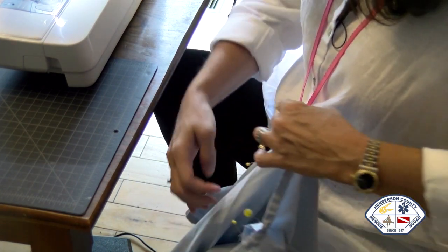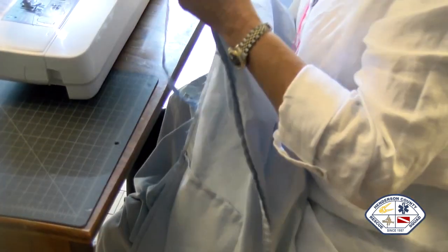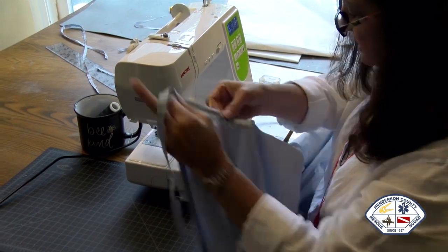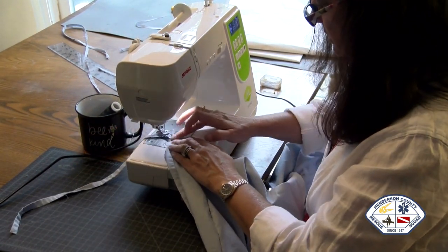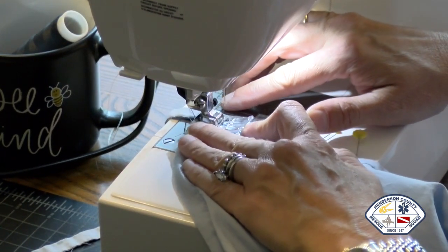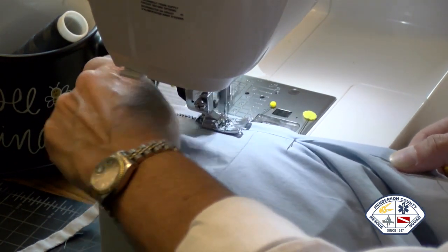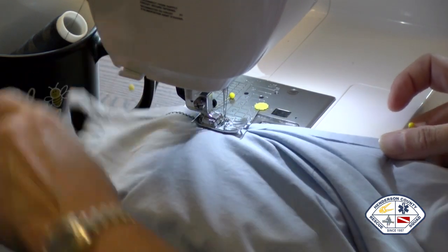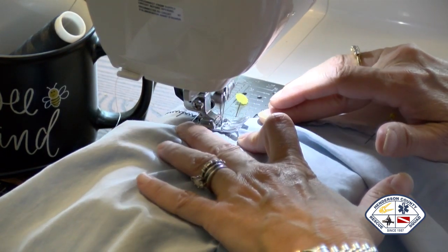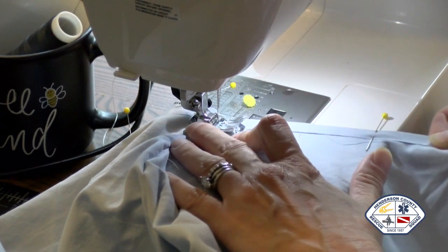Okay, I've done all the way around to both sides of the neck. So let's zigzag this on. And I'm kind of using a small, tight zigzag. We'll zig and we'll zig and we'll zig. Okay, we're going to get to that corner. You want to make sure that your fabric underneath is not boogered up.